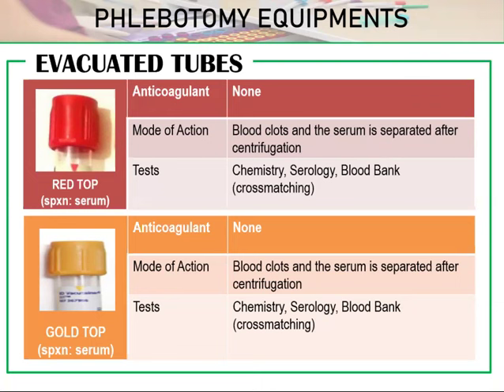Okay. So, this is usually used, class, for chemistry tests. The fasting tests, like fasting blood sugar, cholesterol, lipid profile, our creatinine. So, those tests fall under, or we will be using, our red top.